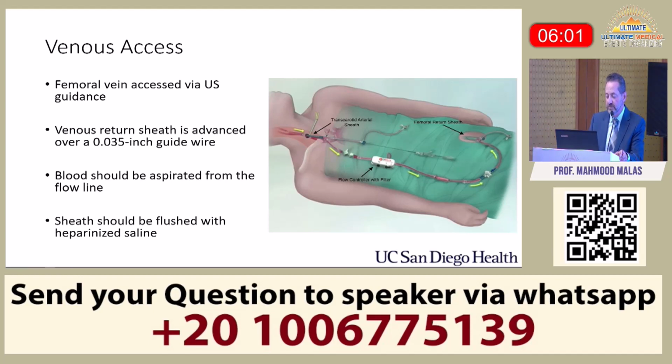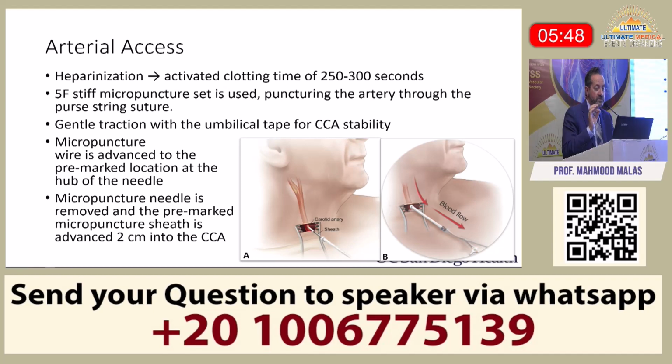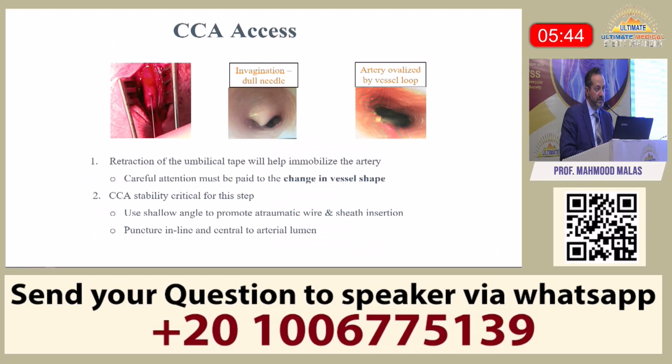Make sure that you're in the vein. I've seen people put the sheath by mistake in the artery. And then you heparinize the patient. I put a purse-string stitch right at the common carotid artery ahead of time, a pre-stitch, and then I use a micropuncture needle and wire to get into the carotid.